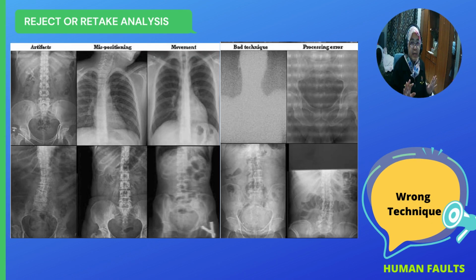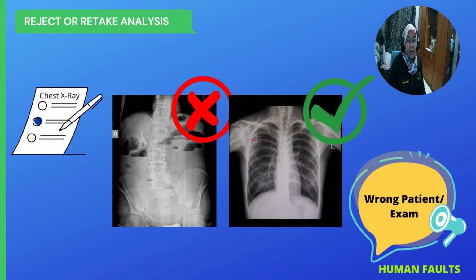This one must be a simple understanding. Wrong technique. As you can see here, very bad technique. The movement and processing error that you must reject or retake. Okay, this is a human fault under wrong patient or exam.